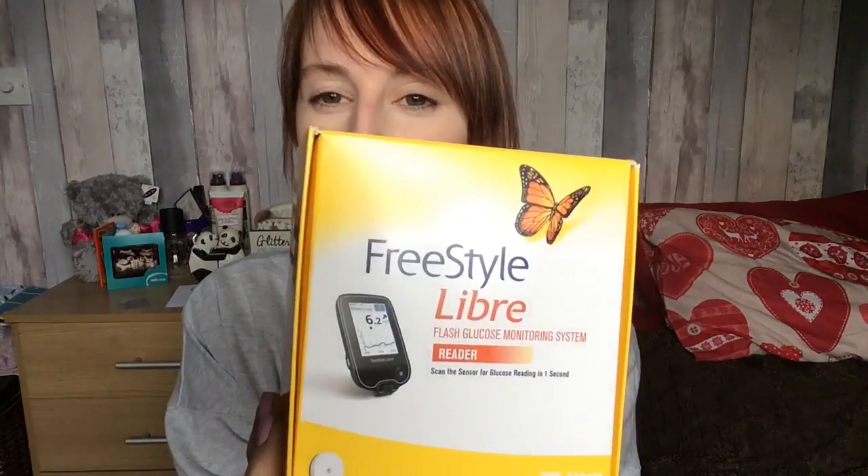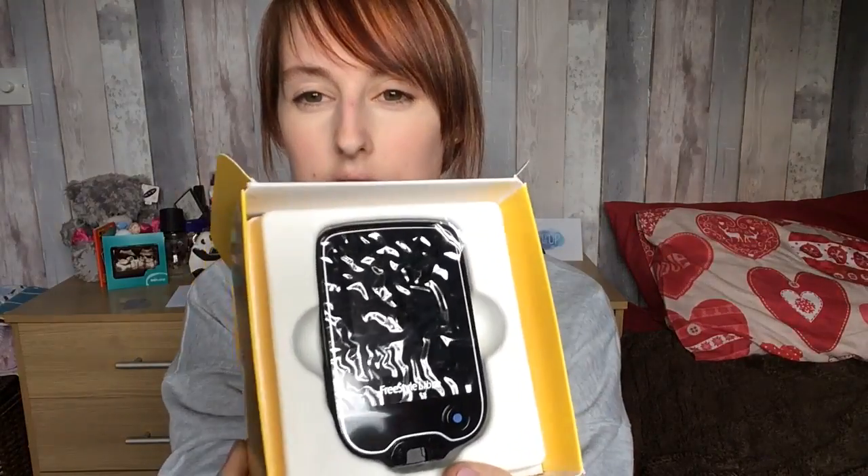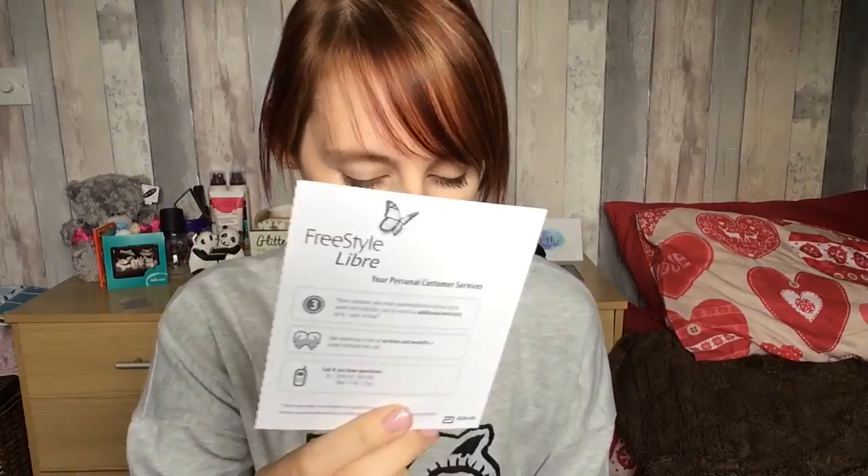So this is the Freestyle Libre reader. You get the user manual and then also the reader itself. Under the reader is the quick start guide. You also get the personal customer services leaflet, a plug to charge your reader, and the USB cable. I'm pretty sure you can link it up to your computer as well.